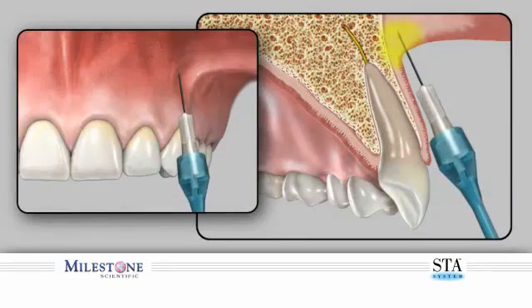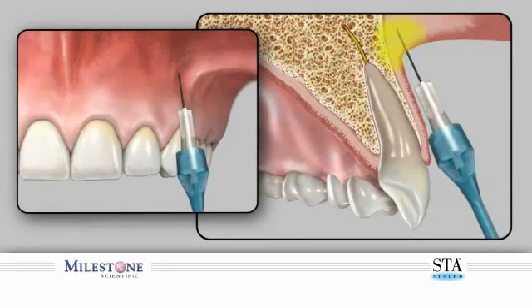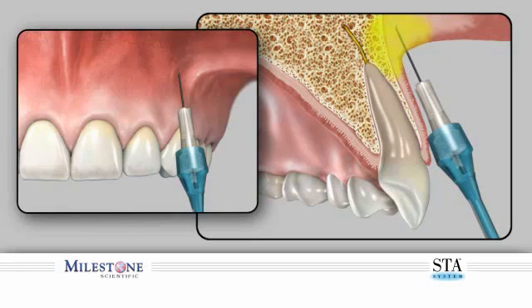If an aspiration test is required for the specific infiltration, perform an aspiration by depressing and releasing the foot control pedal. If the aspiration is negative, you can continue the infiltration injection and administration of anesthetic solution to the area. If aspiration is positive, reposition the needle and perform another aspiration by depressing and releasing the foot control pedal.